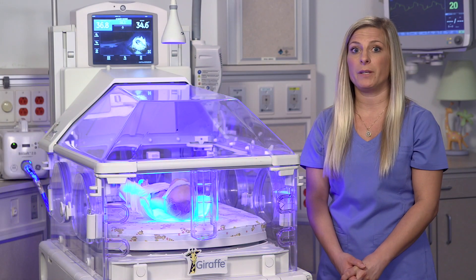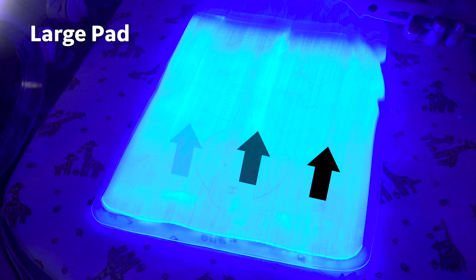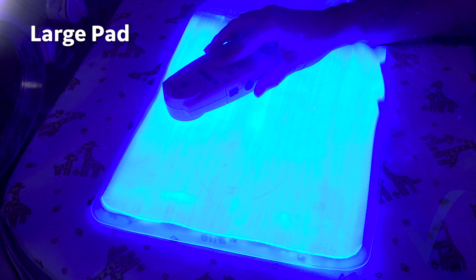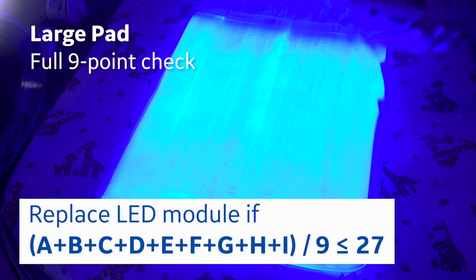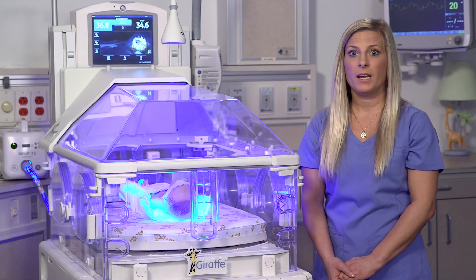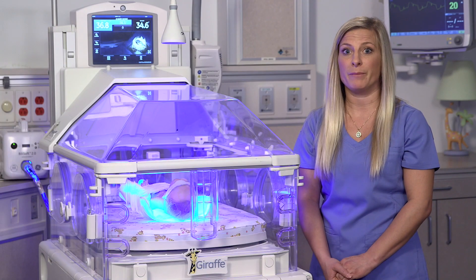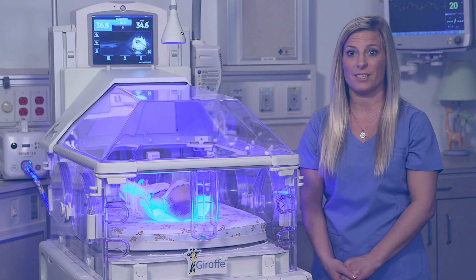If you have the large BillySoft 2.0 pad, for the quick reading check the center row at points D, E, and F and take the average. If it is greater than or equal to 40, then it's okay to use. If it's less than 40, then do the full nine-point check. If the nine-point check result is less than or equal to 27, then it is time to replace the LED. The BillySoft 2.0 unit should work fine for over 50,000 hours of use — an improvement over the old BillySoft phototherapy system, which would need replacement after 8,000 to 10,000 hours.